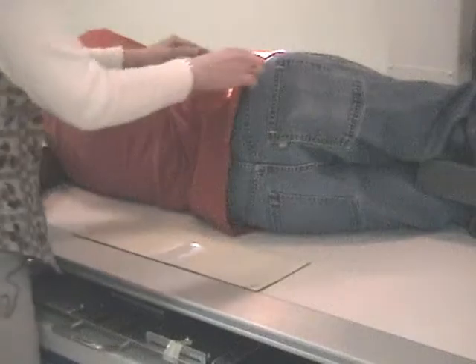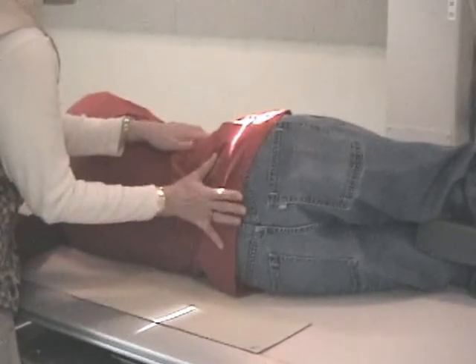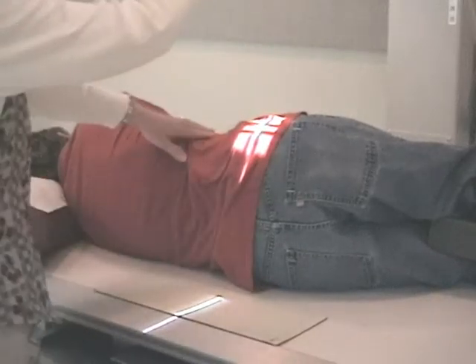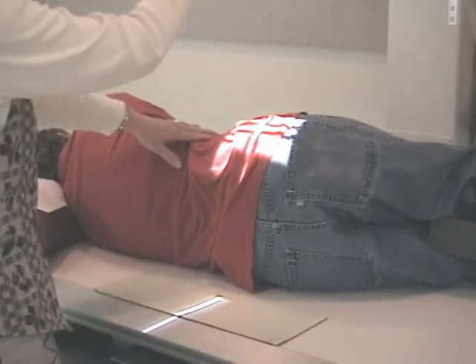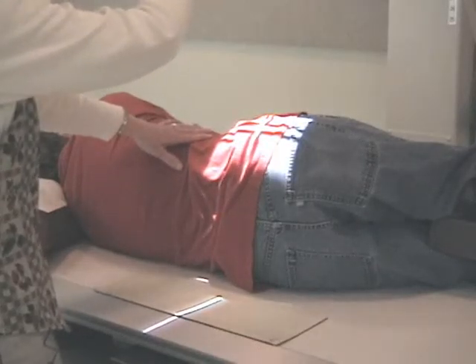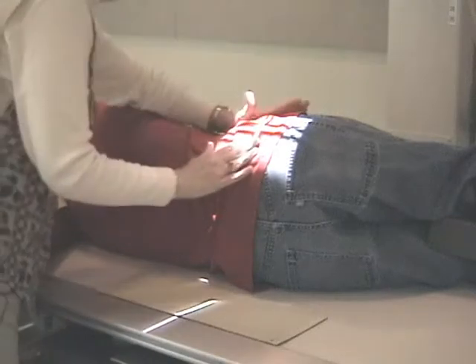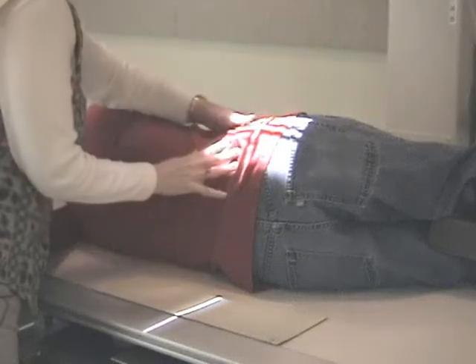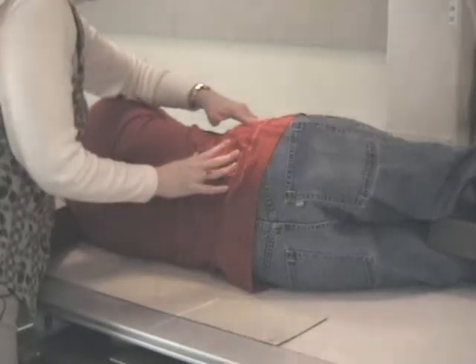Front to back now. The sacrum is very posterior, so I know I need to go that way. And I want 12 inches by approximately 6. I want to find L5. You already know how to find L5. There are 2 ways you can do it. You can use the ASIS and go a couple inches back. We also taught you can find the trochanter. Feel for the trochanter. L5 is slightly behind the trochanter, about 1 inch.